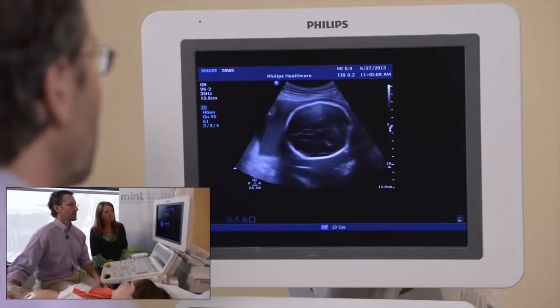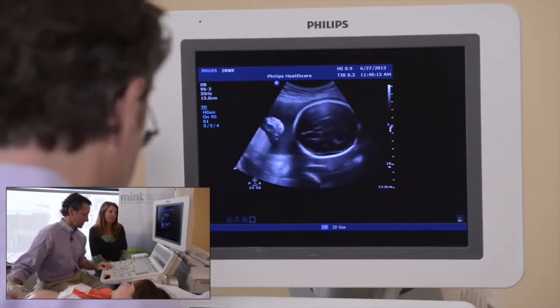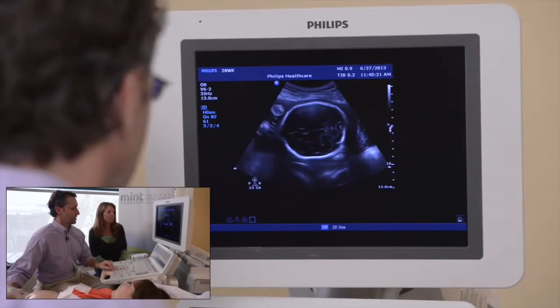I'm going to cover mainly just the overview of the anatomy. We'll go from head to foot and talk about whatever comes up. Michelle, if there are frequent questions that you come across in your classes, then you can let me know.